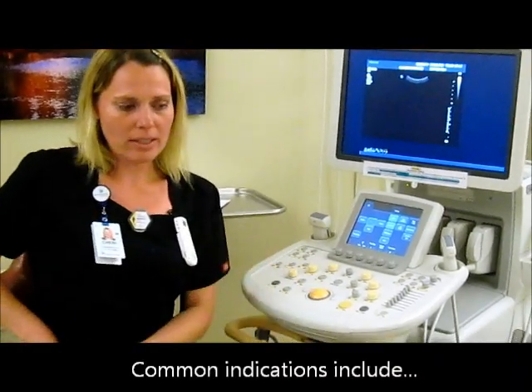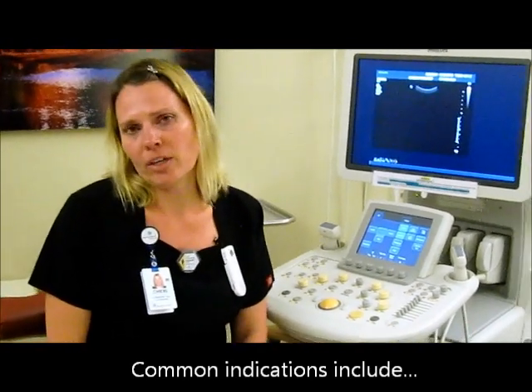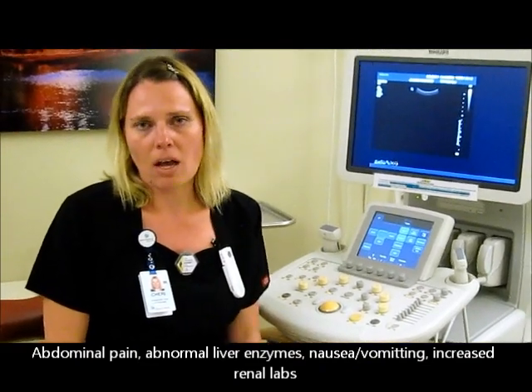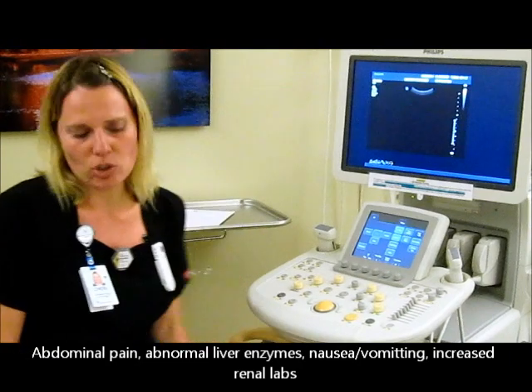Abdomen ultrasounds are normally done. The main purpose of them is abdomen pain. You can have increased liver enzymes. People are nauseous, they're vomiting a lot, increased renal labs, issues like that.